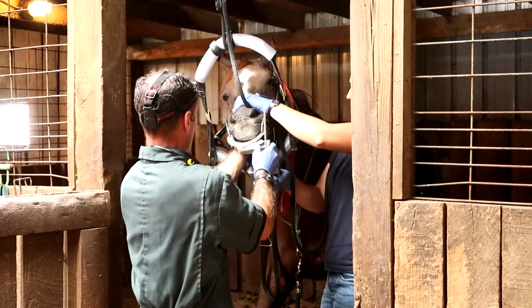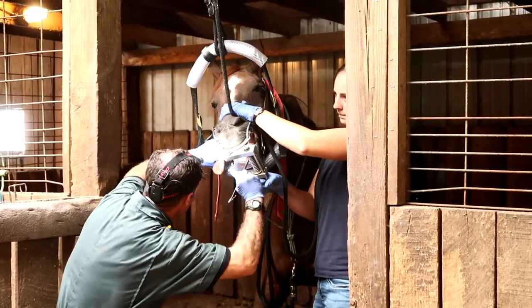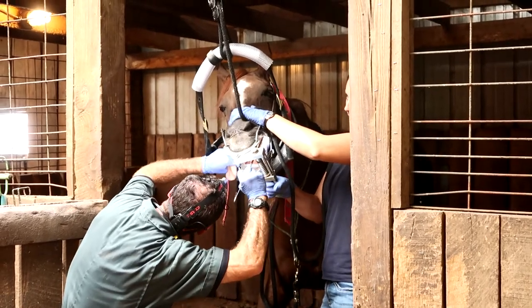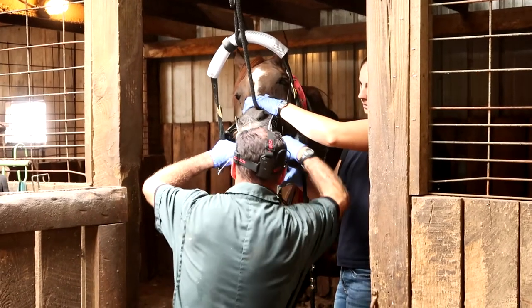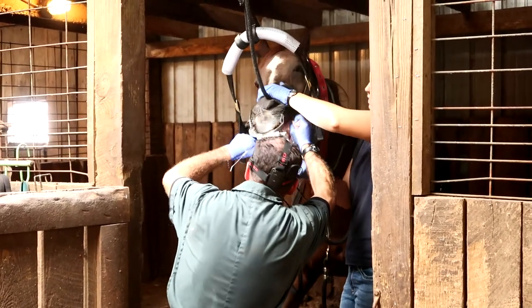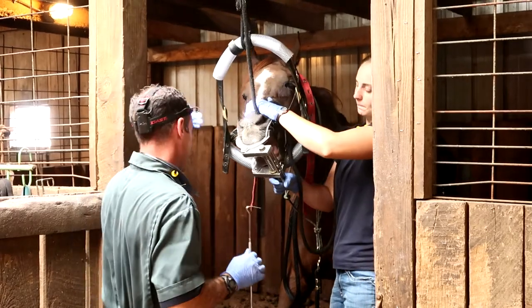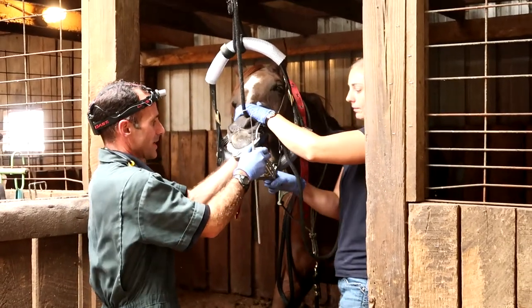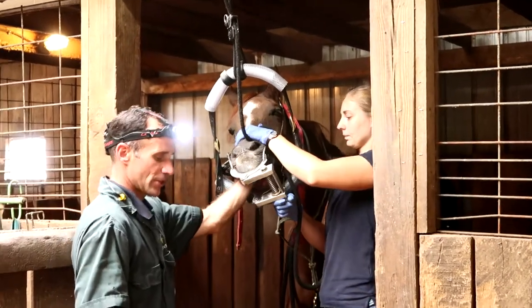You can tell that Tino is a little bit nervous here because he's super mouthy with the speculum, but he calms down a little bit more later. If your horse is like this, your vet can always give them a little bit more sedation, but Dr. Scott opted not to and he did just fine. He just has some rough cheek teeth edges — on the left and right arcade, on the buccal side, he has some really sharp edges, and on the lingual side of his lower inside edges as well.